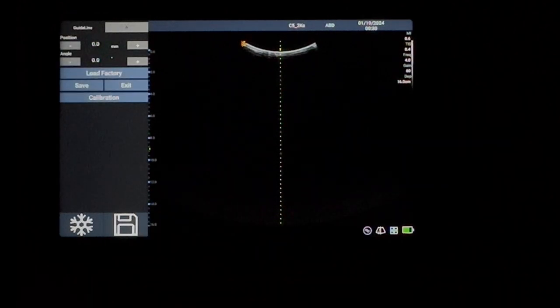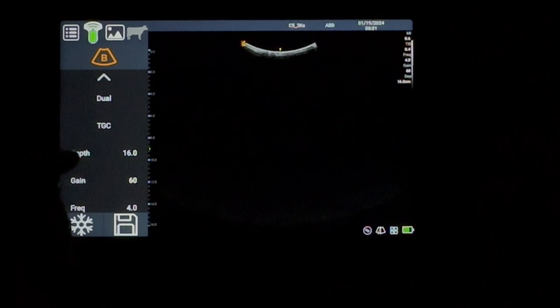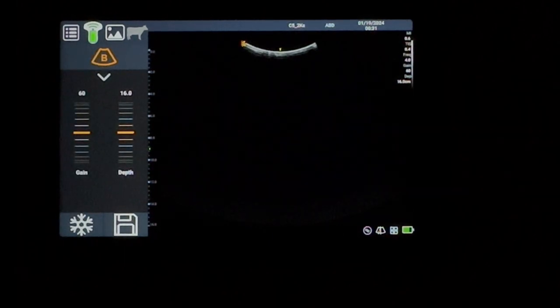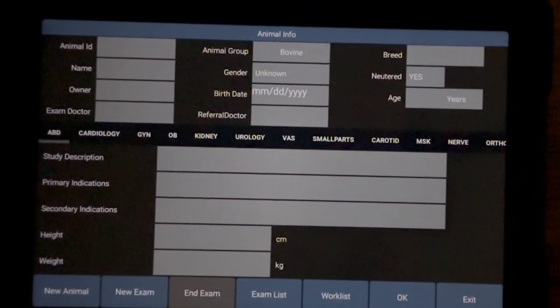At the top you've got your depth, gain, and frequency. If you want to change your frequency you can go into the preset settings or alternatively just tap this arrow here and you've got your frequency, your focus, your position, and you can change all those settings within the device. If you are looking to do a scan and then a diagnostic, at the top here is your diagnostic information. Tap onto that — apologies, this might not be the clearest with my camera — and there we go, that's the diagnostic screen.